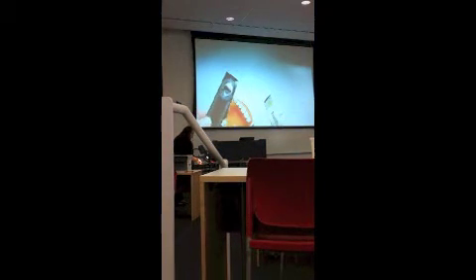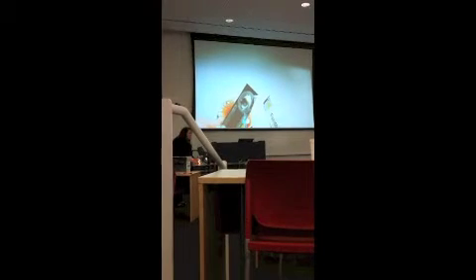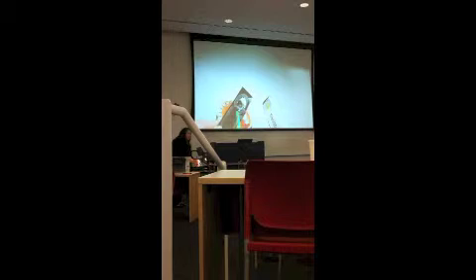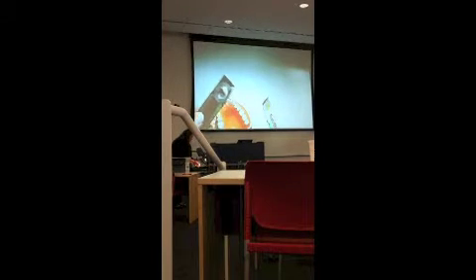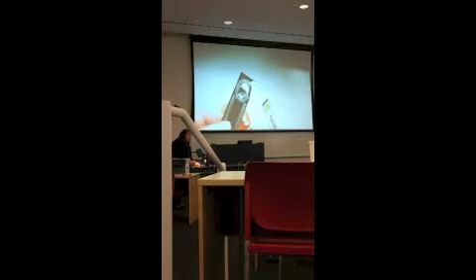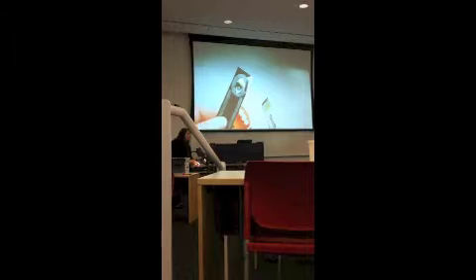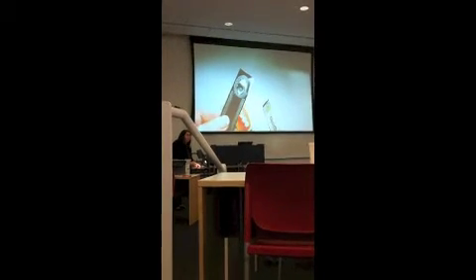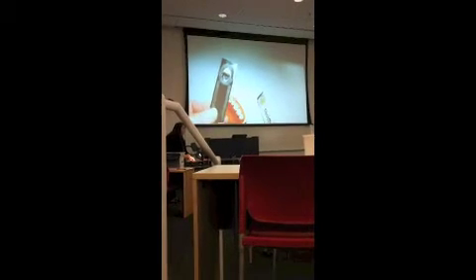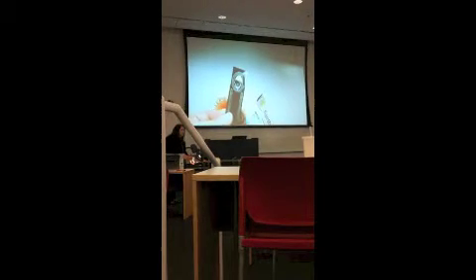And then you usually want to mix the varnish. It kind of separates a little bit. So before you apply it to the teeth, you're going to mix it very well for a few seconds. I don't want to get it all over the Typodont, so I'm not going to do that. But what you can do in clinic tomorrow is have your assistant do it for you. Okay, you're going to have an assistant there so they can mix it for you, or they can peel the cover off and then hold it like this for you, and you can mix it yourself.